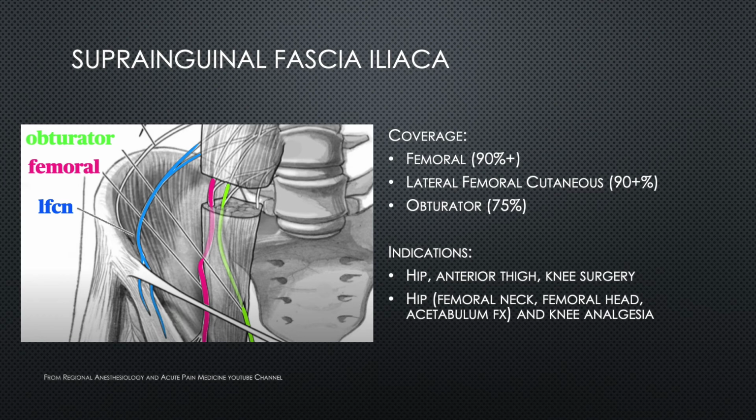And lastly, we're going to cover the suprainguinal fascia iliaca. This block lacks the infrainguinal fascia iliaca shortcomings by having a more reliable obturator coverage, and is useful as analgesia for hip fractures involving the acetabulum.